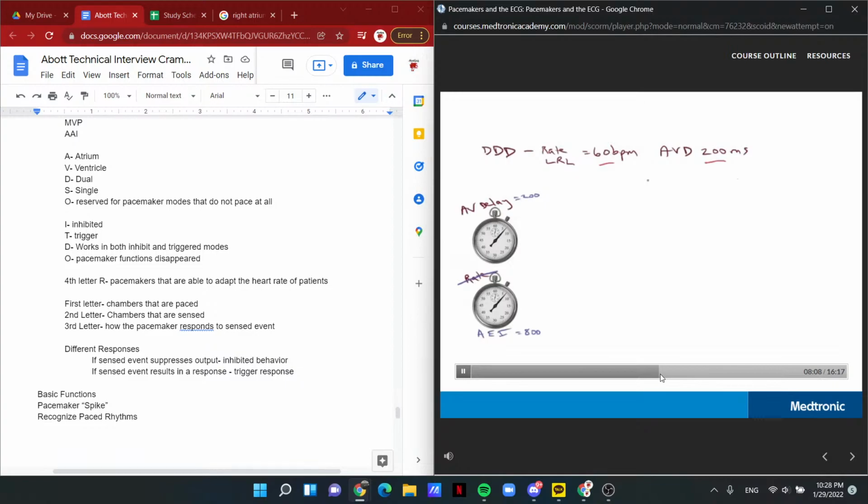However, let's assume that this patient received the pacemaker because of sinus node dysfunction, but their AV conduction is quite good. In this case, what happens is an atrial pacing spike results in a P wave, but that P wave manages to get down the AV node fairly quickly, resulting in a normal QRS complex.